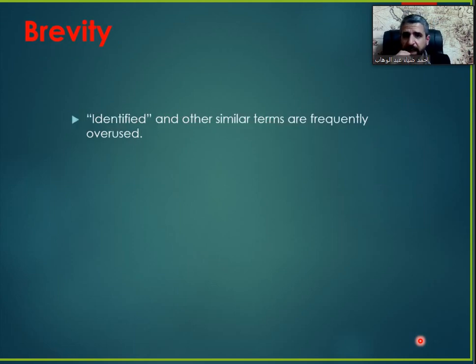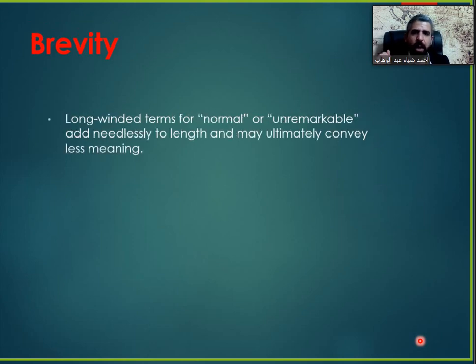So the word identified and other similar terms are frequently overused. Don't mention a lot of identified. For example, if you write the right lung nodule is again identified and unchanged, it's redundant, it's extra. You can write the right lung nodule is unchanged, and that's it. No need for the word identified and some similar words to that. Okay.